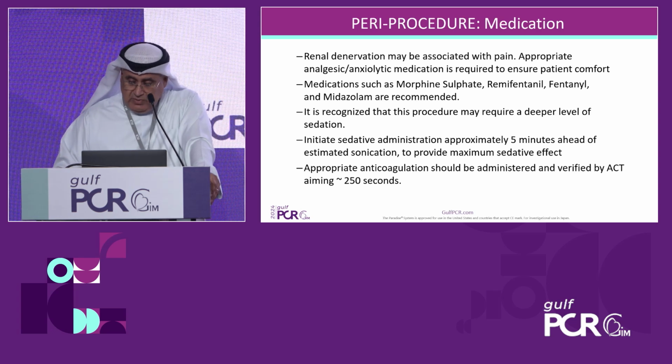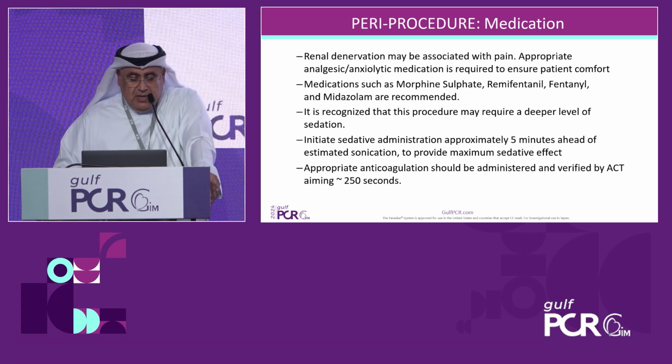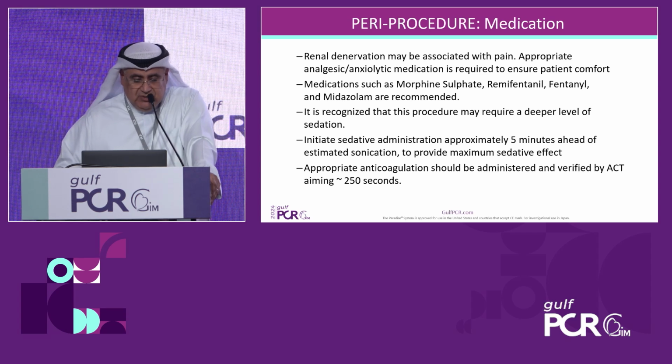For sure, we have seen how painful this could be during the ablation. And unfortunately, this is so in both modalities. It is also recognized that this might require increasing the sedative just prior to the ablation. And then we have to maintain an ACT of 250 seconds.